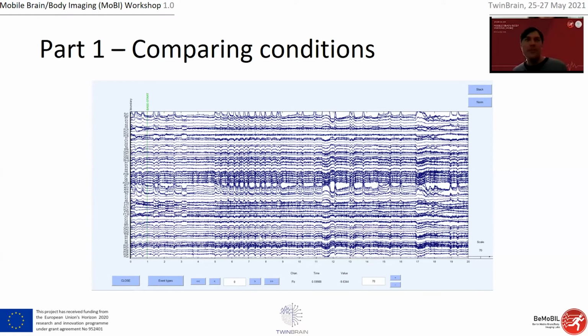And what I also would suggest, that's a bit of an old-fashioned viewpoint, but I'm still doing that, is scrolling the data and marking the bad segments. Meaning, if you already have the segments defined that you use as your EEG of interest, you can still, even after automatic pre-processing, check if there are remaining fishy things in your data set.